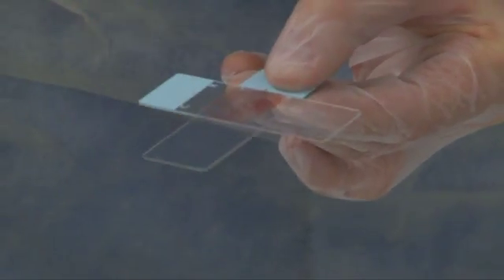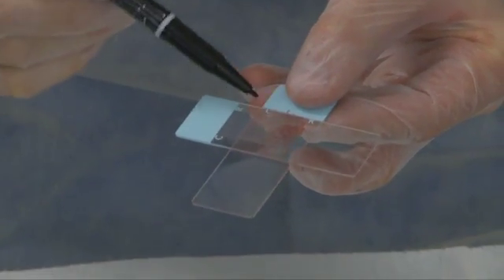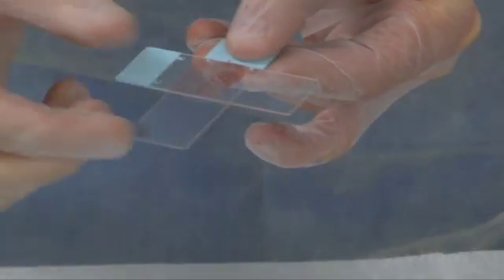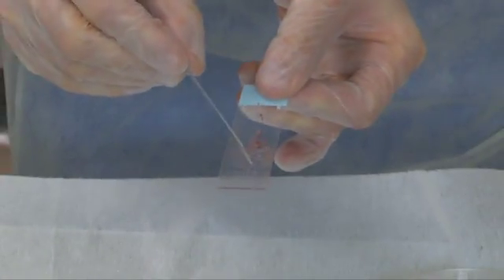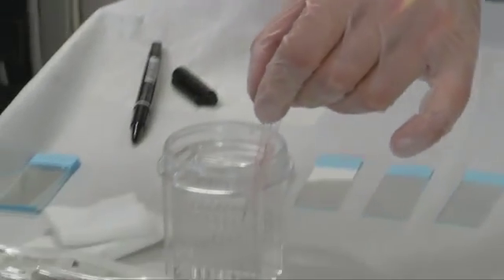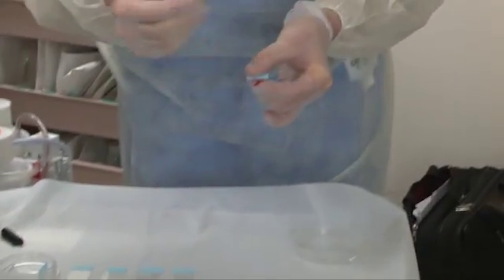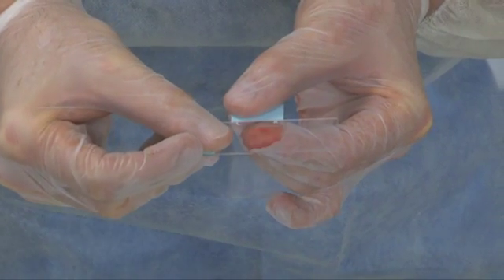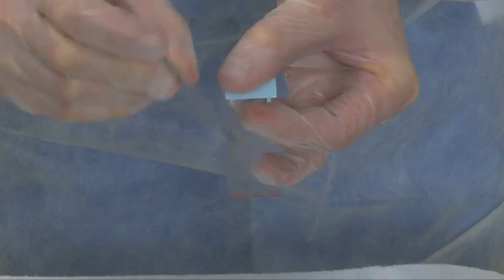So what we can see here very nicely is that I definitely have material. You see here, these are some coagula, but here in this area you see whitish grayish material, and these are definitely cells. So I smear them off, and you see here also very nicely in the center, these are definitely cells. So we don't have the luxury of an on-site pathologist, but that's why we are doing it like this, because this is a reliable marker that you have material. So we know we have a lot of material. So here you see very nicely the areas where there are a lot of cells.